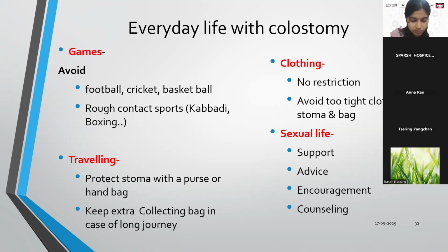So this should be seen. Then traveling. There is no such restriction on traveling. They can travel. The only thing is that they have to protect the stoma with a kind of bag or purse, and always take an extra collecting bag when they are going for a long journey.